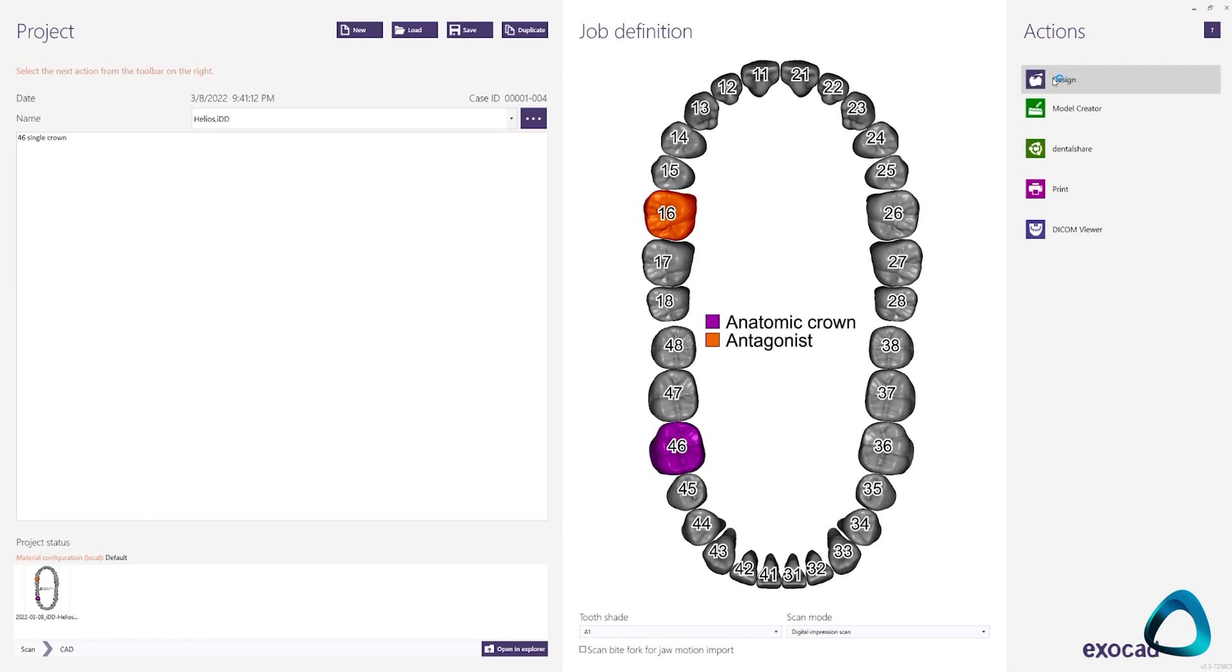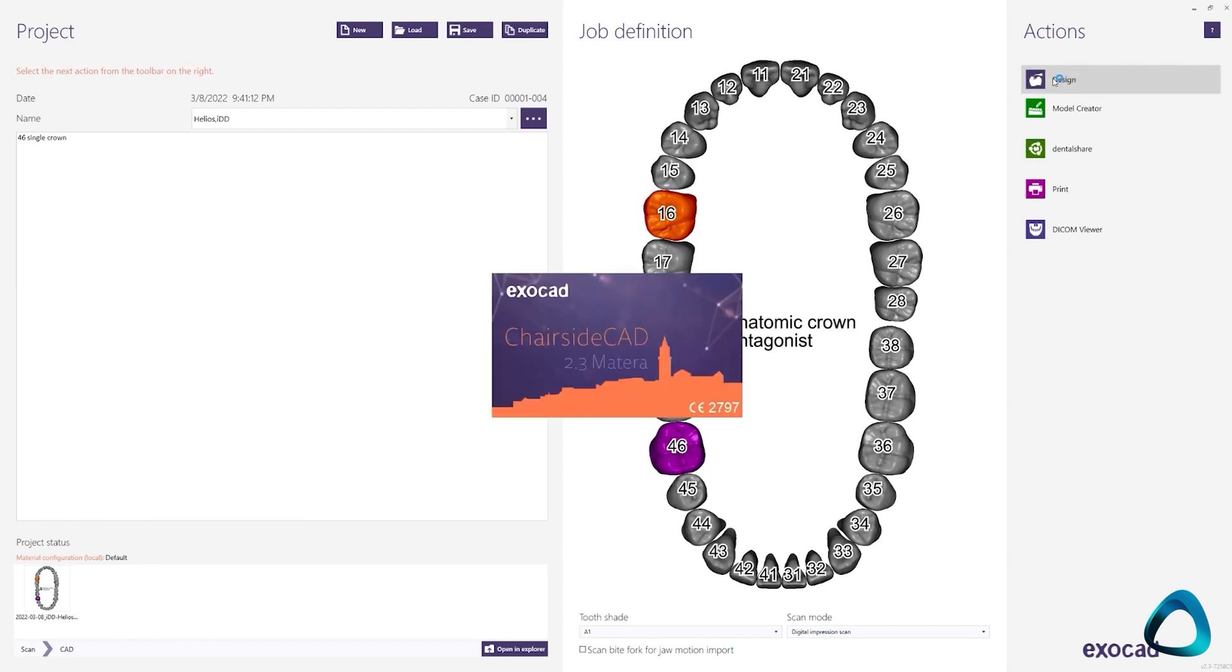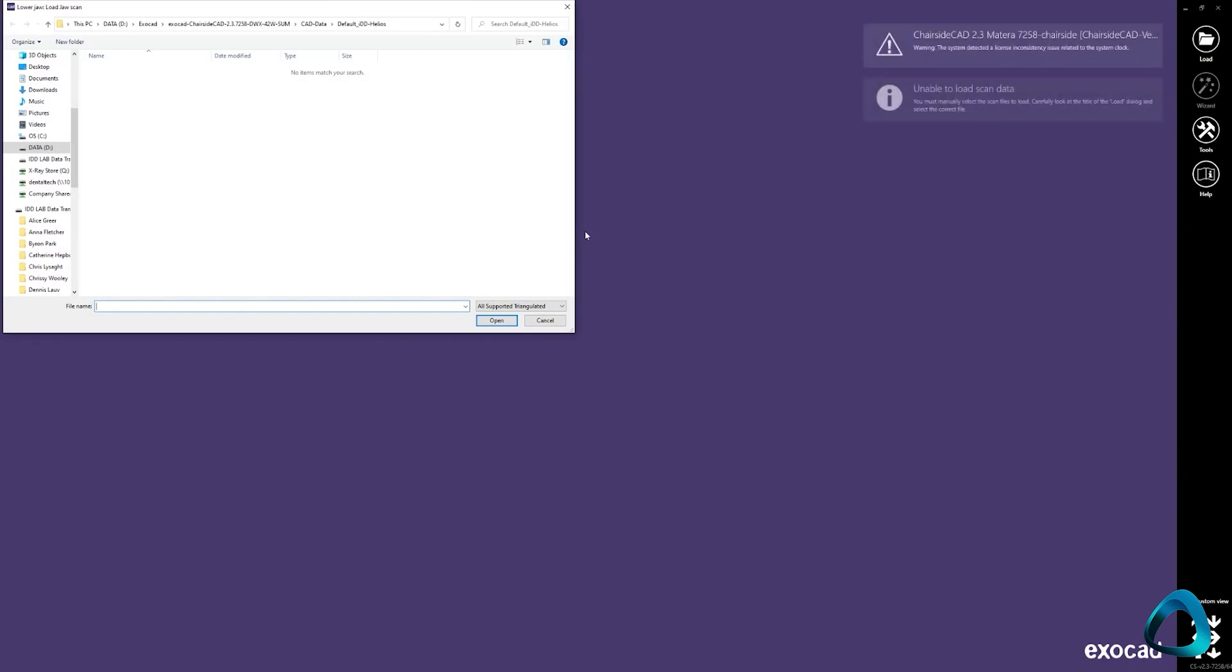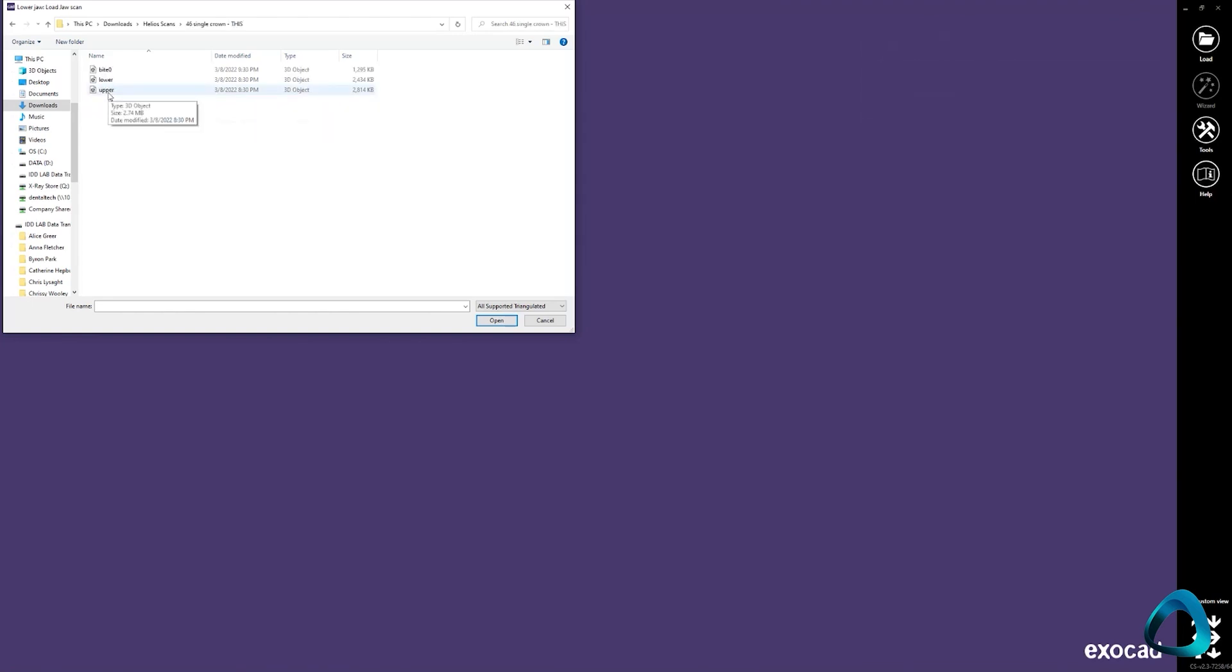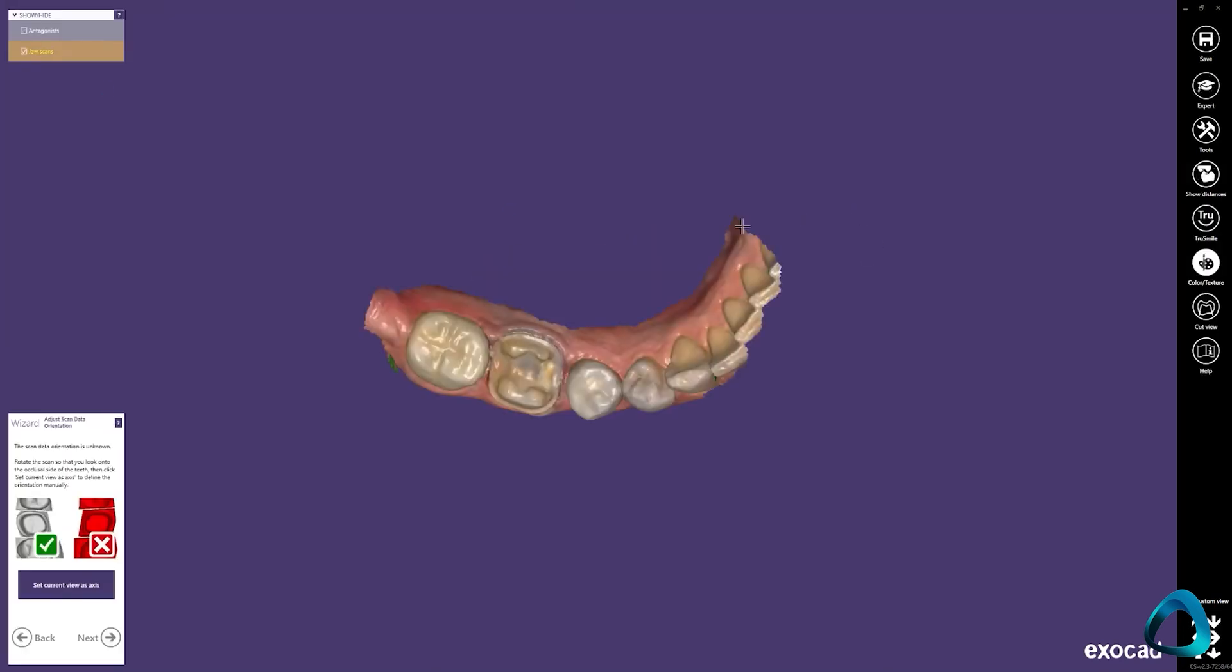Second, you import your scans. The Helios 600 scanner enables easy exporting of STL and PLY scans. I suggest using the PLY file type when you can because this is a color file and it can be easier to identify the tooth margins when the models are in color. However, both STL and PLY work fine. So as you can see, I'm importing the scans and then the next part of the workflow is orientating the scans as per the instructions on the software.